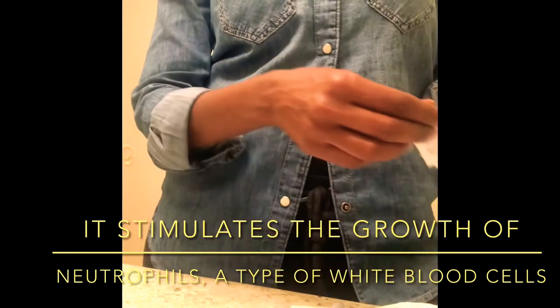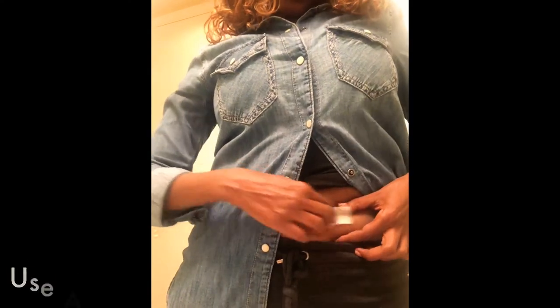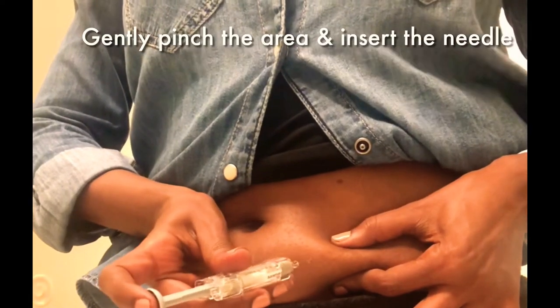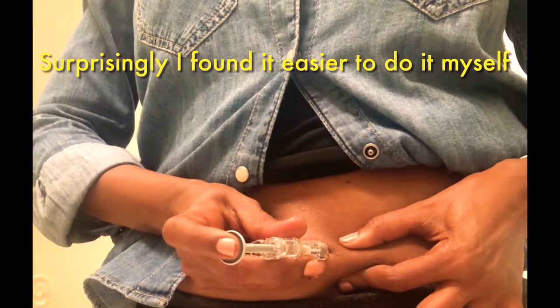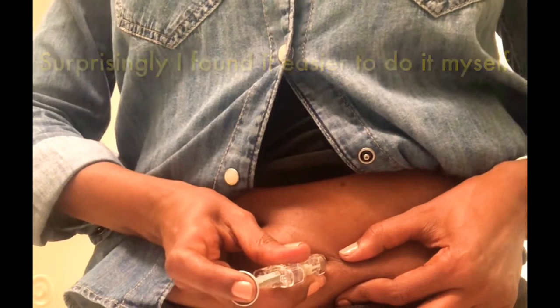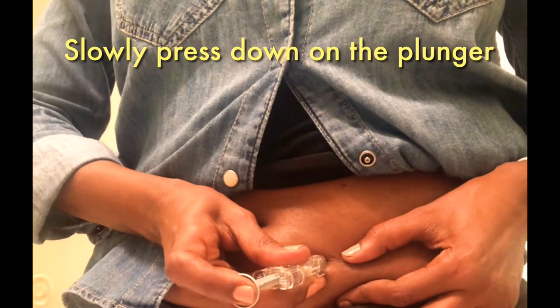I'm just going to demonstrate how I have finally mastered this. You slowly push it — if you do it too fast it hurts and stings. The key is to push it in a little bit; it's hard to control, but — ouch.